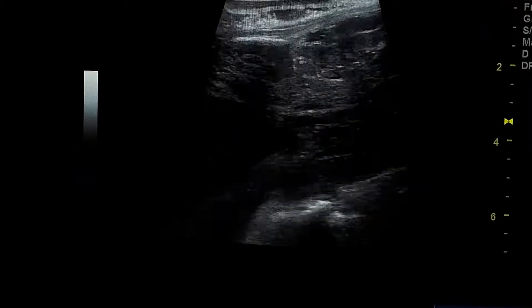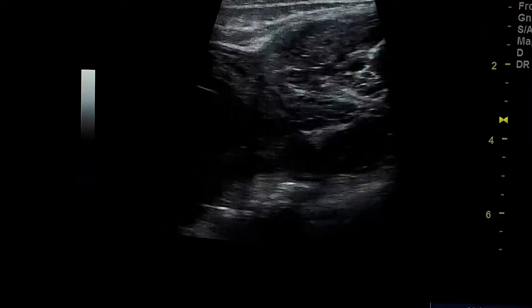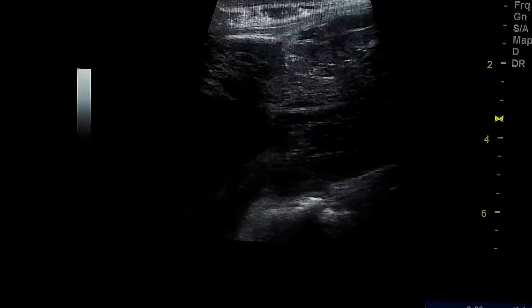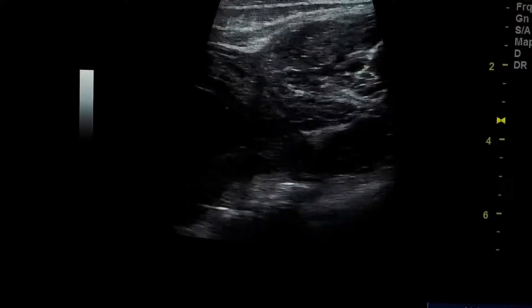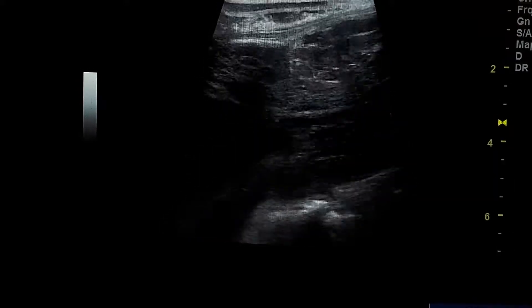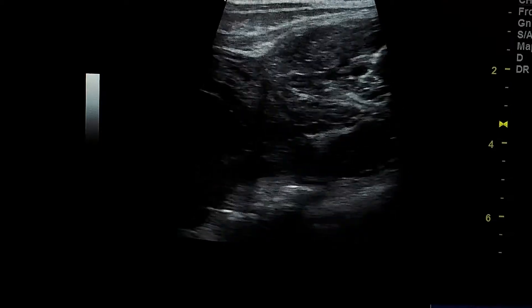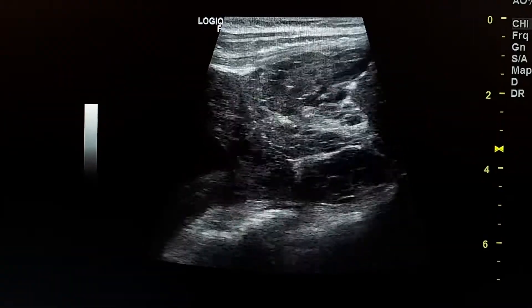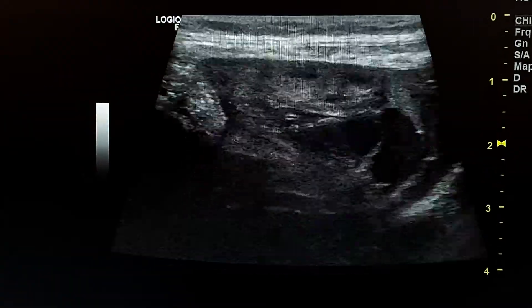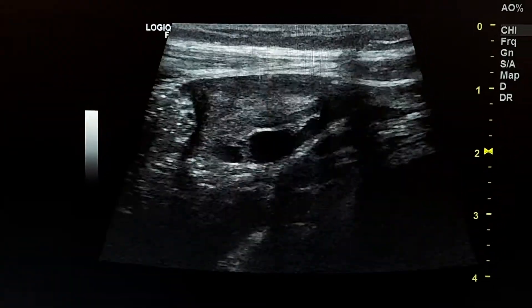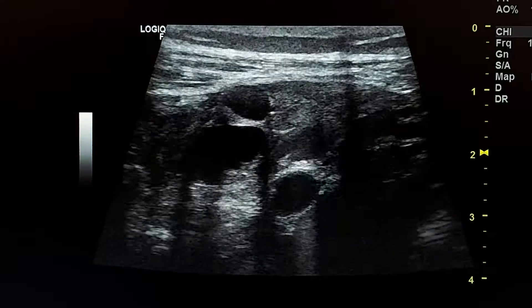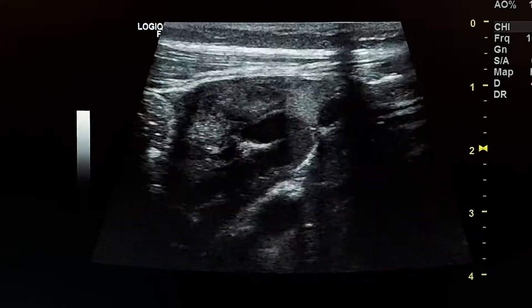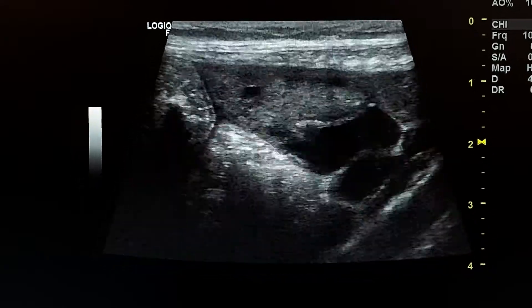At surgery, the left ovary was ruptured and very dark. This was the right normal ovary. This is the right adnexa. Thank you.